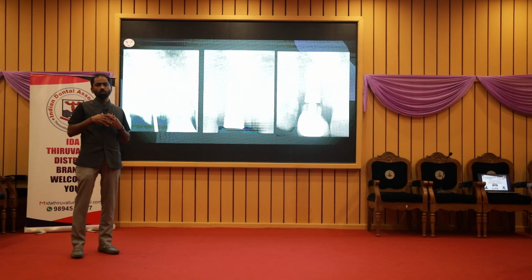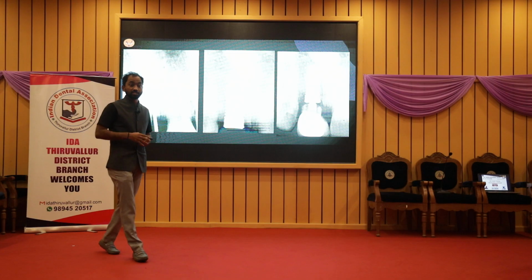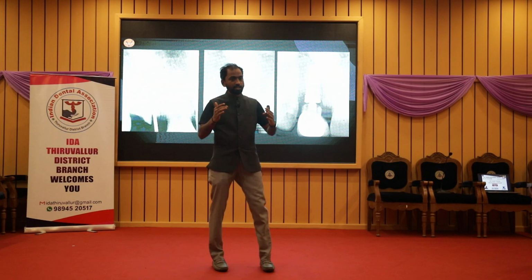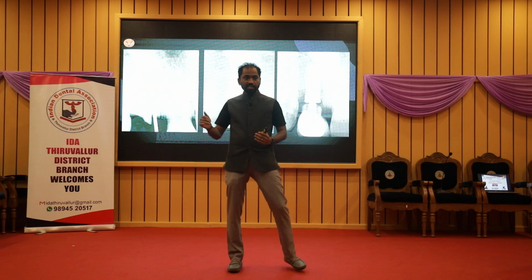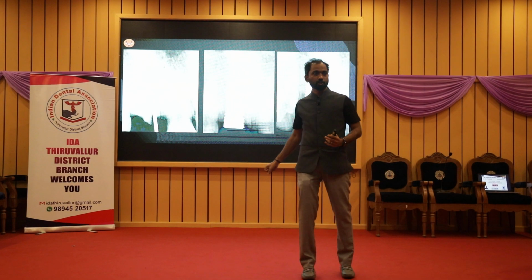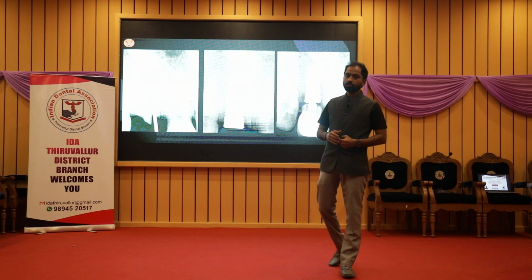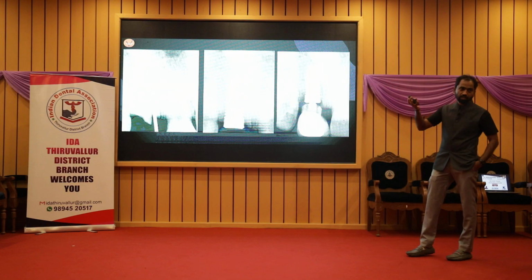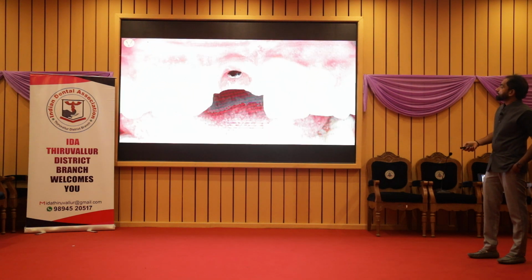So there is no justification to give such a long implant, because if this fails, that much amount of bone is also going to go, because it will slowly eat away the bone till the end. But if something is happening to this implant, if it is halfway, then you will identify it, you can remove it, do some regenerative procedure, and put another implant. That is possible. So keep some bone for implants. That is something which I try to follow. Of course, I heard it from my mentors and I am trying to follow that.